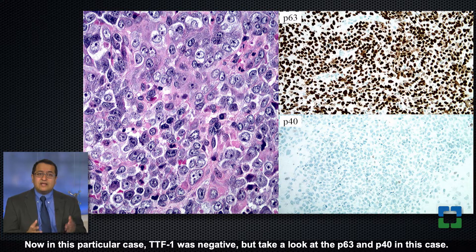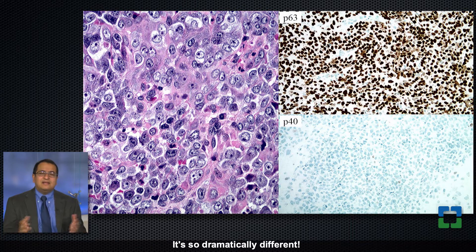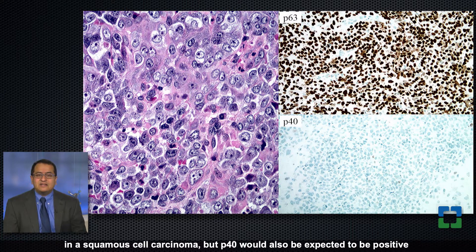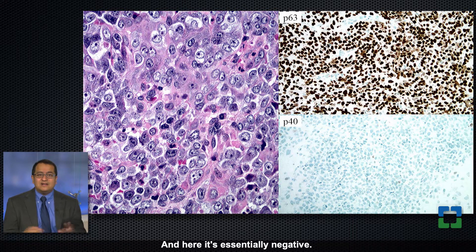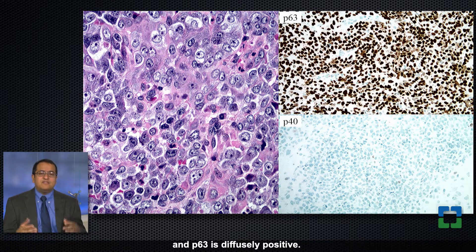In this particular case TTF1 was negative, but look at p63 and p40 — it's so dramatically different. The p63 shows strong and diffuse nuclear positivity of the kind you would expect in a squamous cell carcinoma, but p40 would also be expected to be positive in squamous cell carcinoma, and here it's essentially negative. Maybe you can find a rare positive cell, but essentially p40 is negative and p63 is diffusely positive.